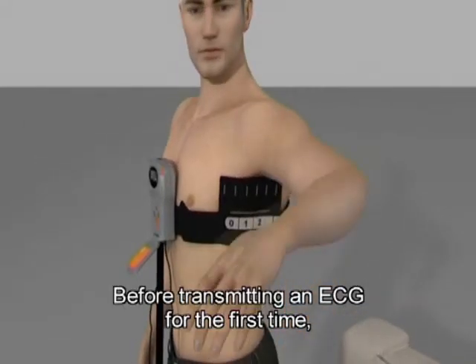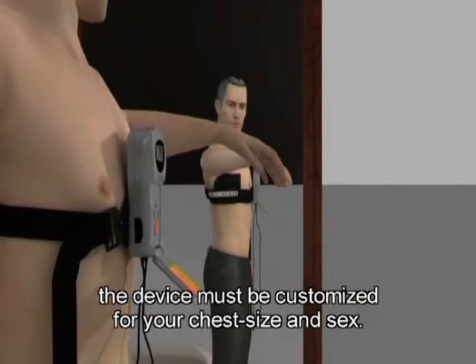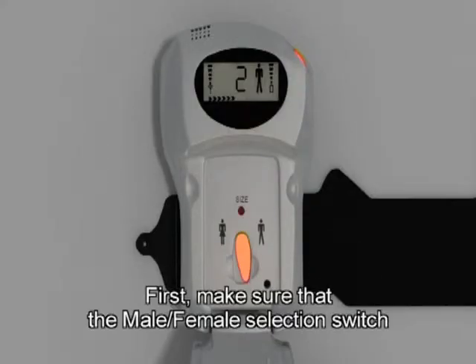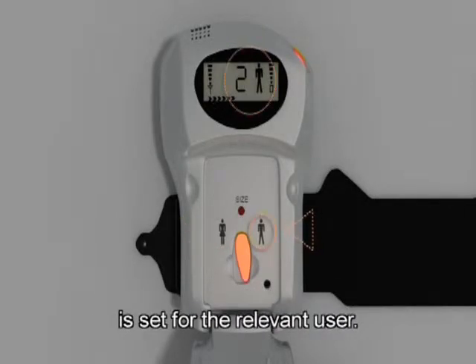Before transmitting an ECG for the first time, the device must be customised for your chest size and sex. You need to do this only once for each user. First, make sure that the male-female selection switch is in the correct position, so that the measurement taken is set for the relevant user.